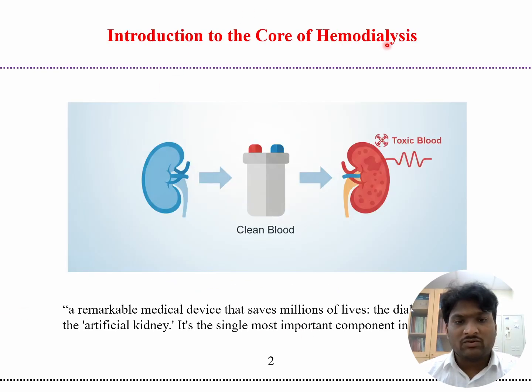An introduction to the core of hemodialysis: a remarkable medical device that saves millions of lives. The dialyzer, also known as the artificial kidney, is the single most important component in hemodialysis.